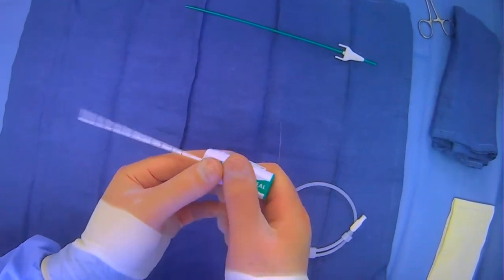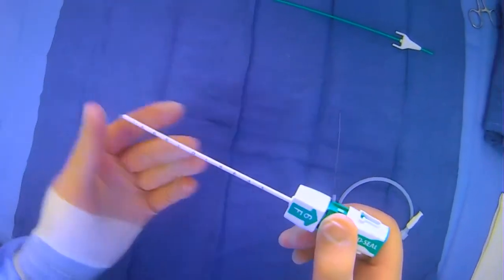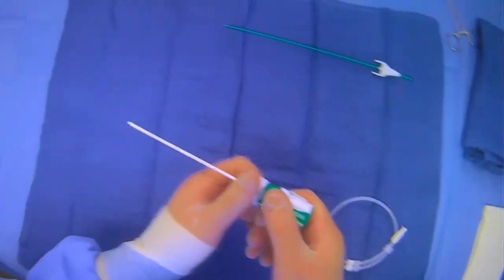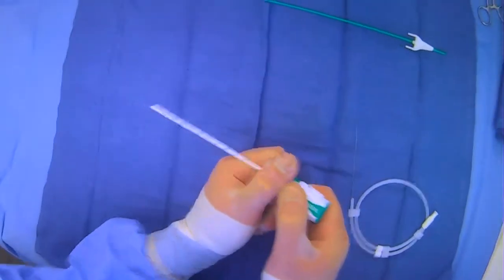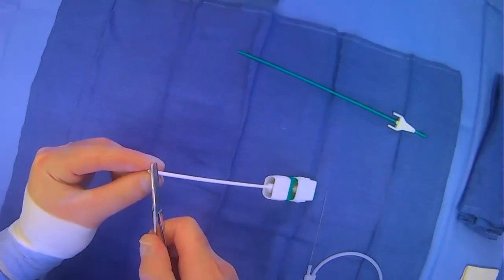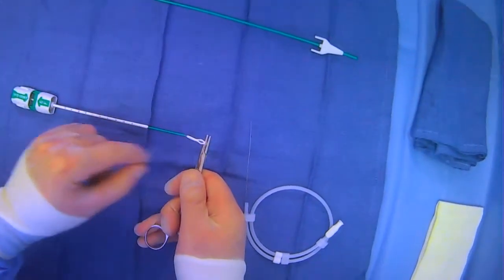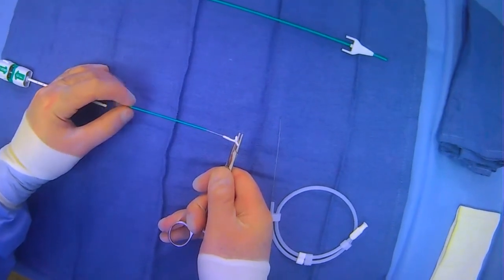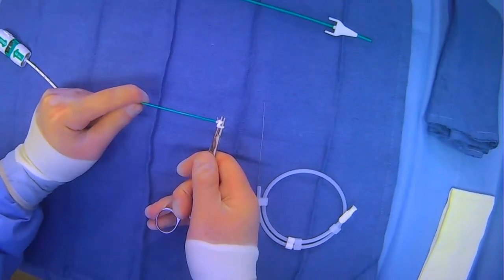When you actually remove it, you'll pull back like this and you'll hear another click, which means the anchor has been locked into place and no longer moves. Then you'll pull back this whole device. There's a collagen plug that actually comes out, and you'll see a little tamp-down device.